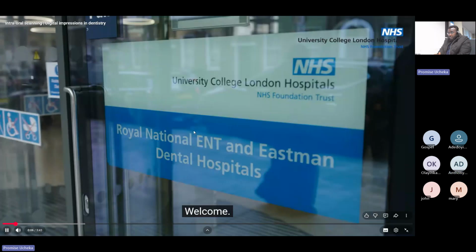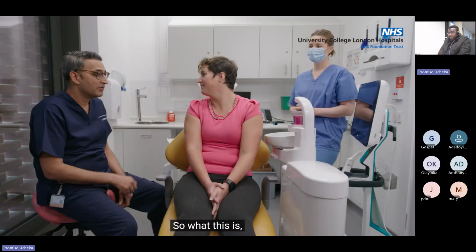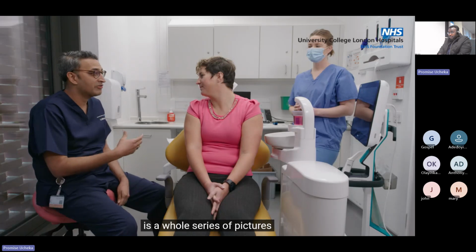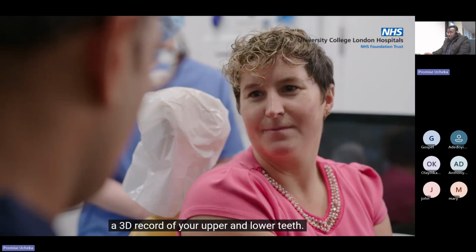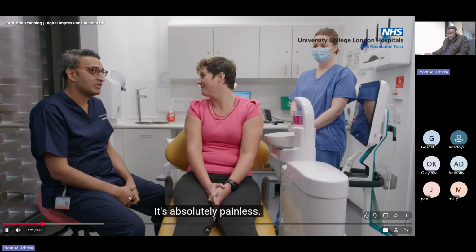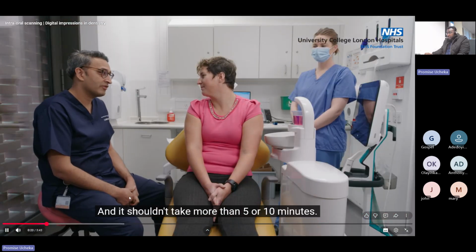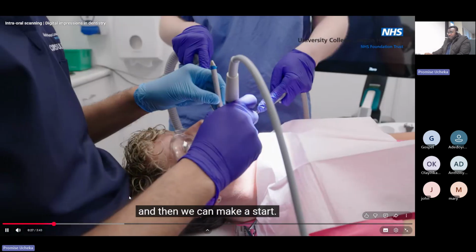For us to take an intraoral digital scan of your teeth. What this is, is a series of pictures which are stitched together to provide a 3D record of your upper and lower teeth. It's very safe, it's absolutely painless, and it shouldn't take more than 5 or 10 minutes. We're just going to give your teeth a quick clean, and then we can make a start.